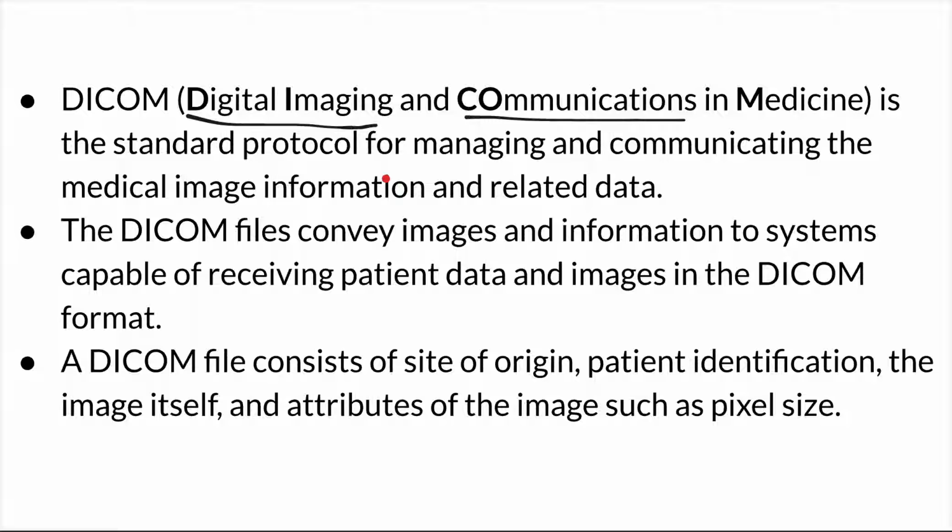So we use it to manage and communicate medical images. In terms of sharing, for two modalities to be able to share files, we have to put all of them on this protocol so that communication is possible. It's similar to how our internet works. Before you get on the internet, there are protocols you need to follow. All our devices follow the protocol.